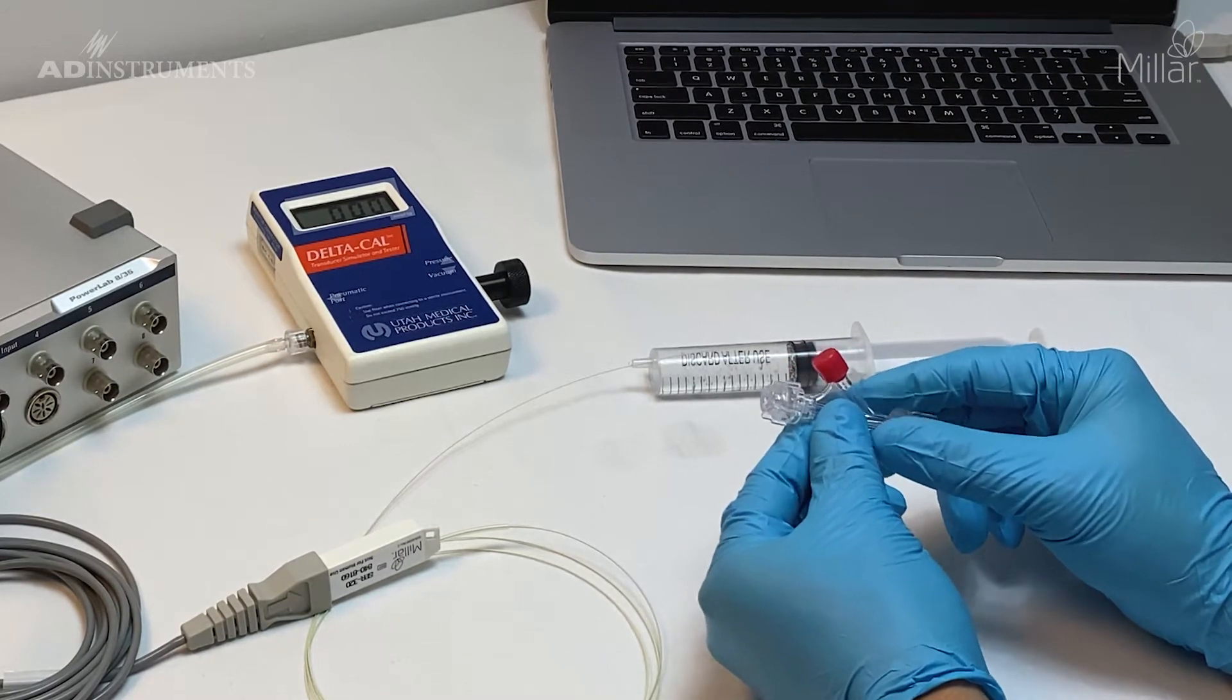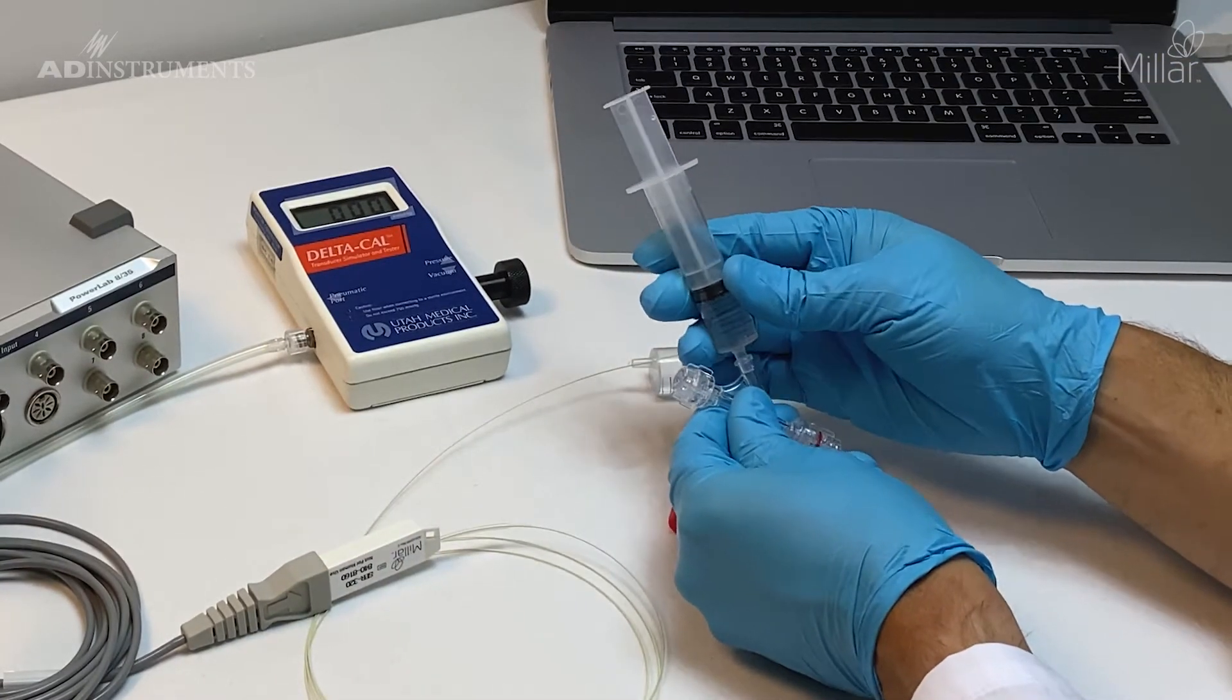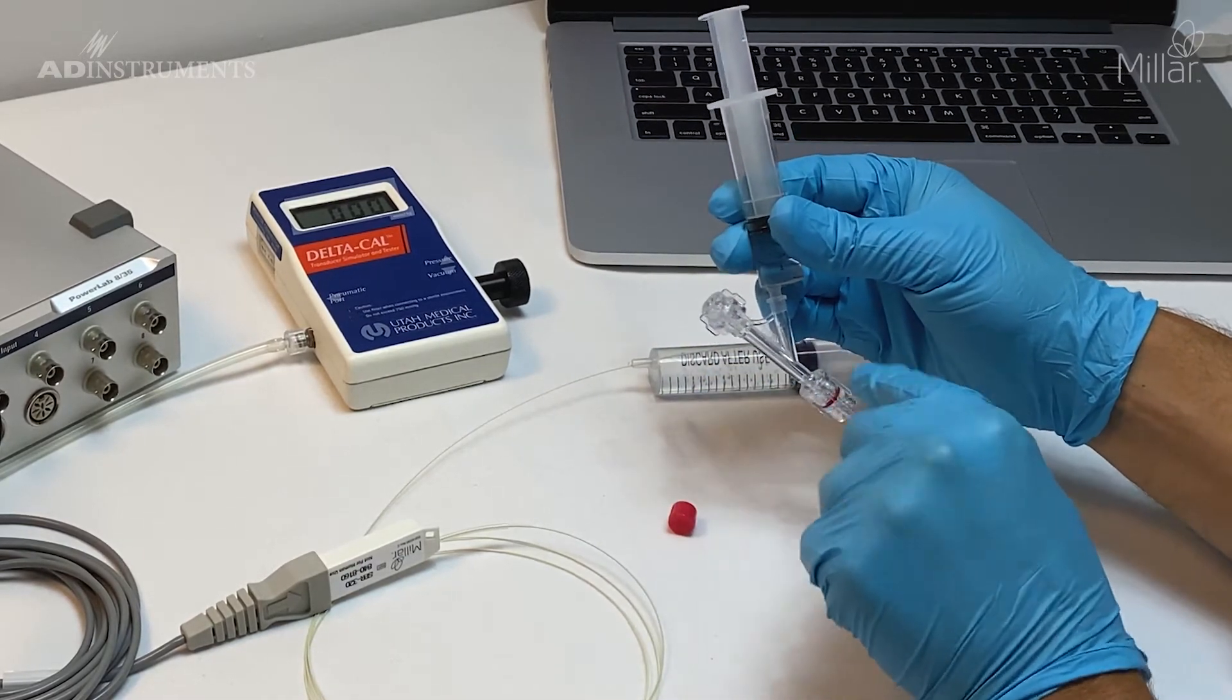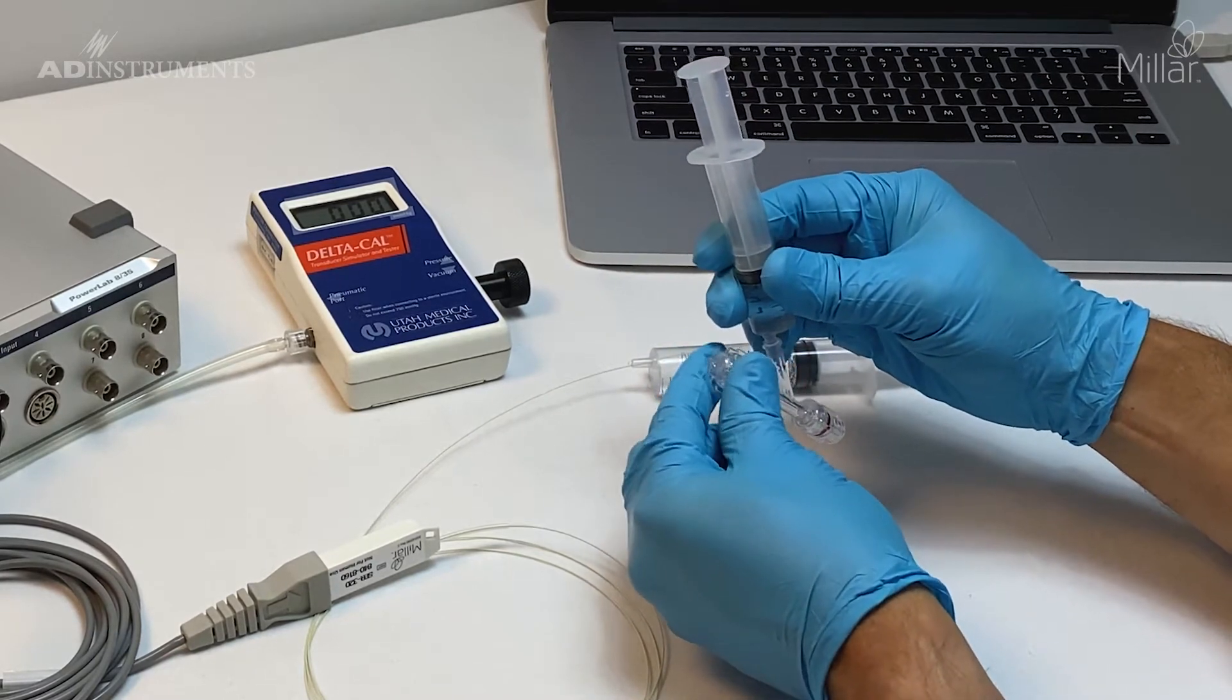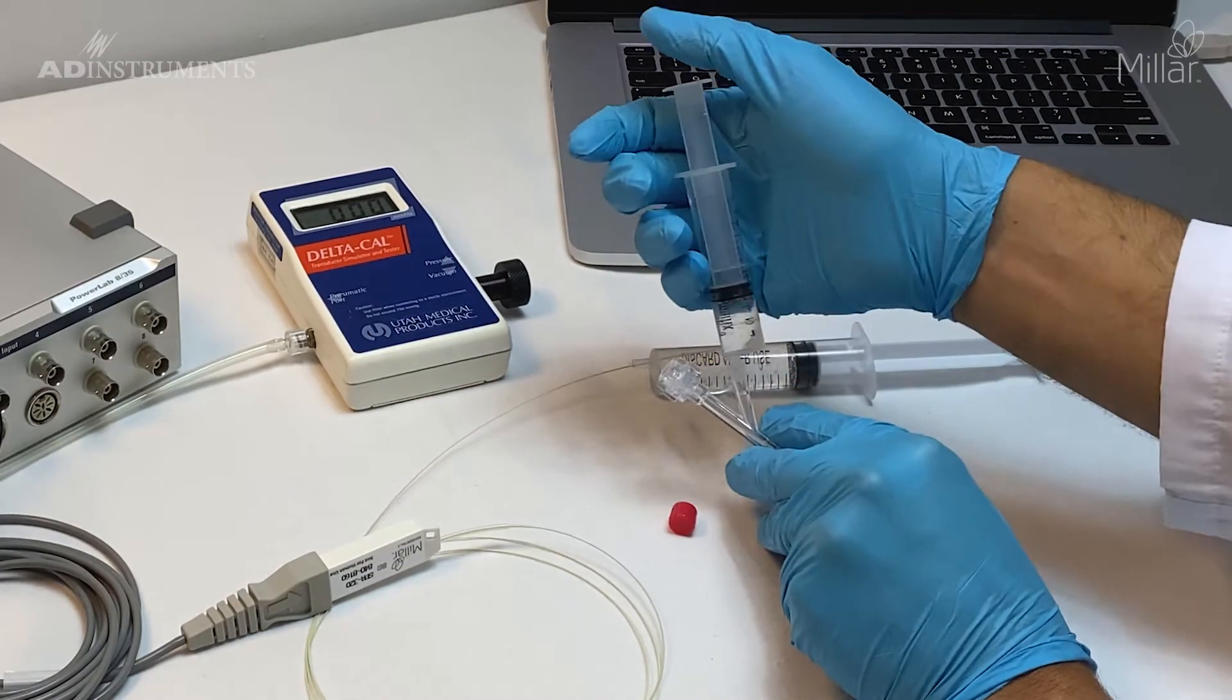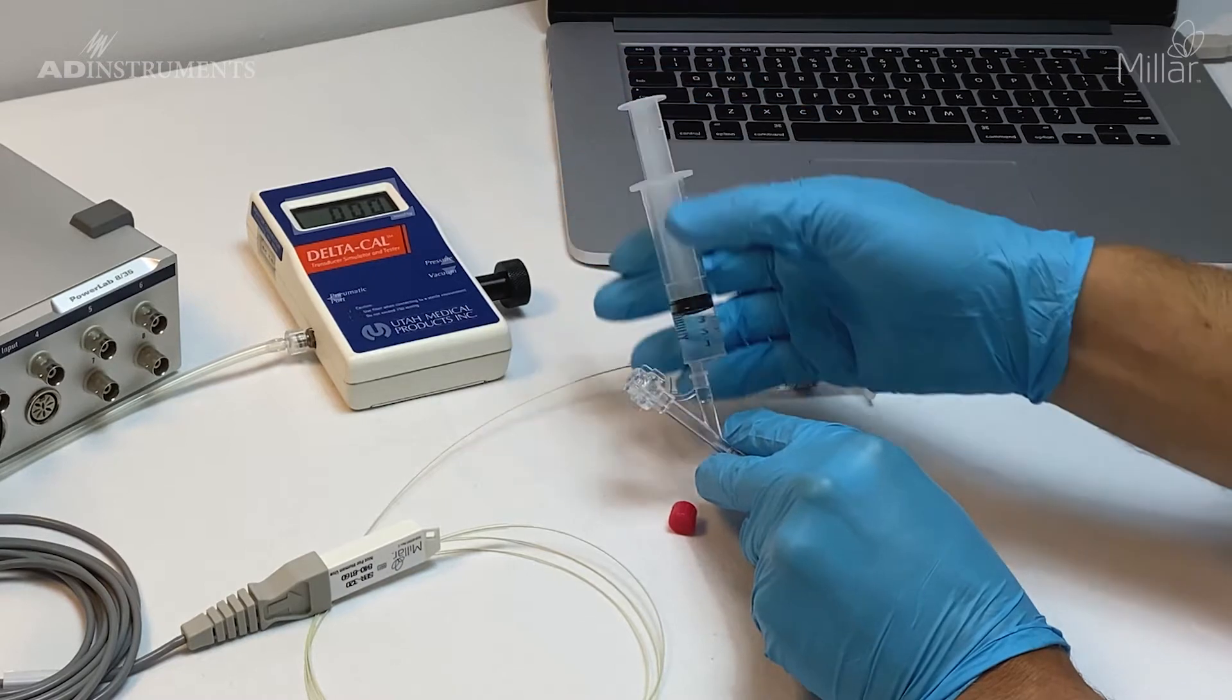First, I'll remove the red cap and connect a syringe with warm saline. I'll block off this end, make sure the other end is fully open, then slowly fill it up with saline.